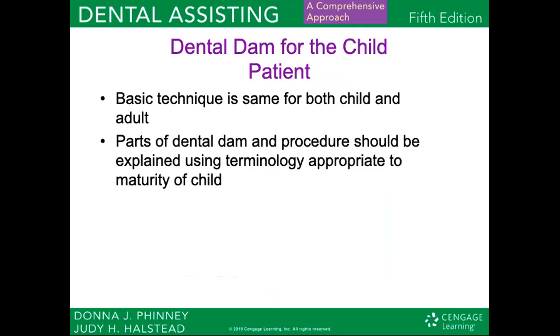So when you're placing it on a child, it can be a little bit more complicated. Basically, the technique is pretty much the same for both a child and an adult, but there are parts of the dental dam and the procedure that should be explained using the terminology that the child will respond to. So instead of using technical terms, what you definitely don't want to do with a child, you want to use terms that they would understand.